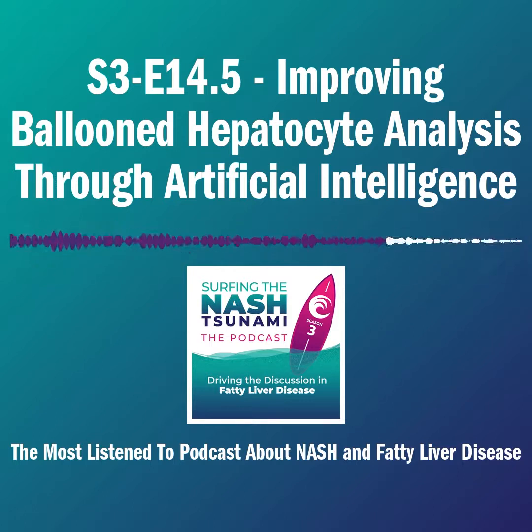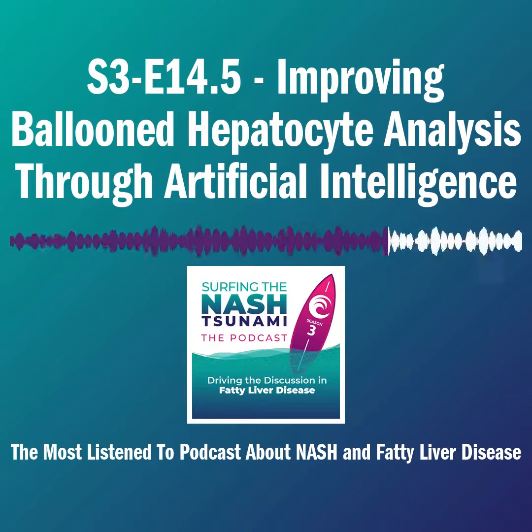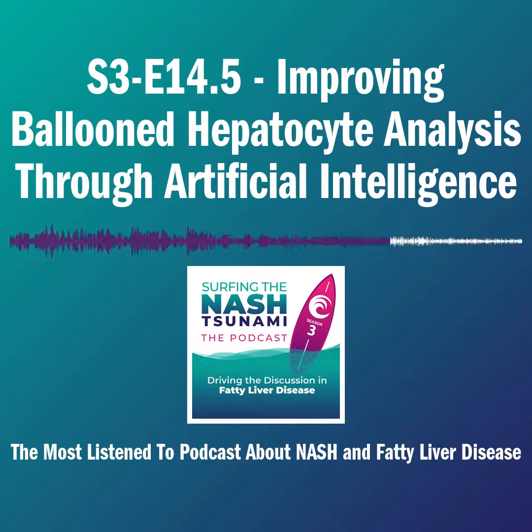So this is something very interesting we're actually trying to do. When we did this correlation that Mazen described, we didn't dig in too much into that, and I think it's a very interesting question. We should really expand more into looking at this septa versus nodule. Also, the type of septa, the thickness and the structure of it, could address whether this is really something that's progressing or regressing. That's something that I'm very interested in, and particularly important in drug trials, of course.